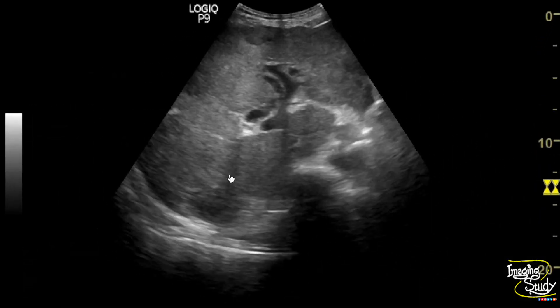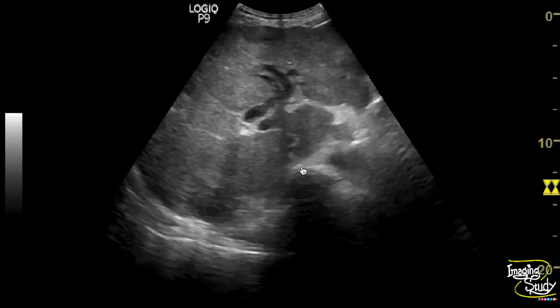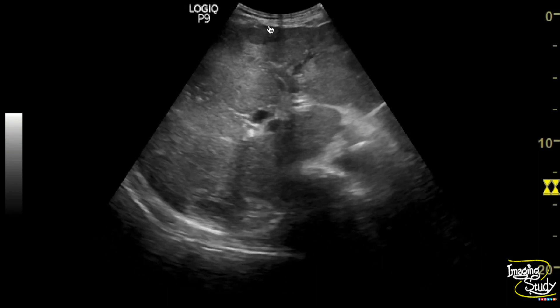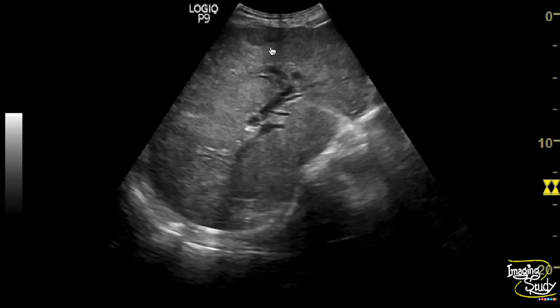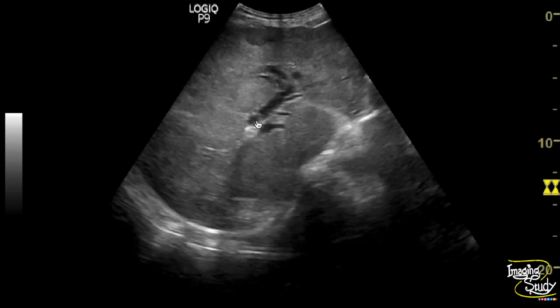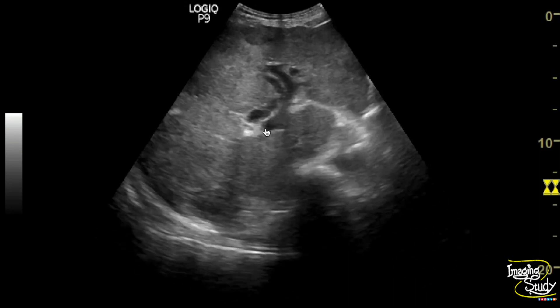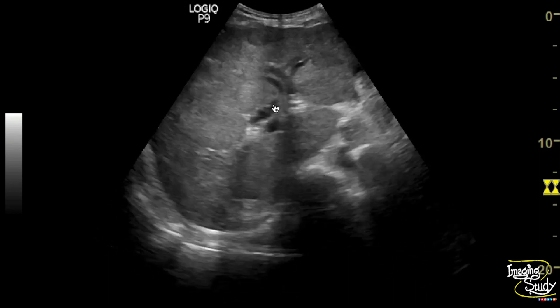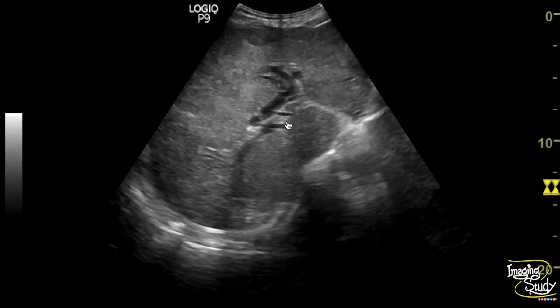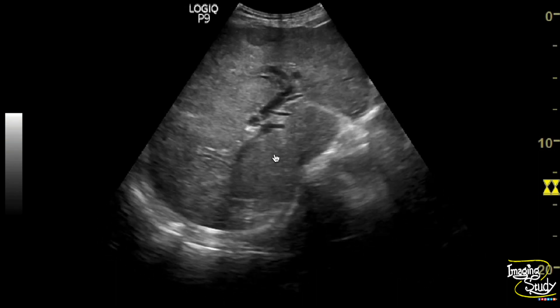Here you can see part of the liver. The hepatic parenchyma is slightly heterogeneous. There is a hypoechoic space-occupying lesion at around segment 4. You can see the portal vein, and the common bile duct anterior to it is dilated — on measurement it was around 9 mm. The intrahepatic channels are also mildly dilated, especially on the left side.